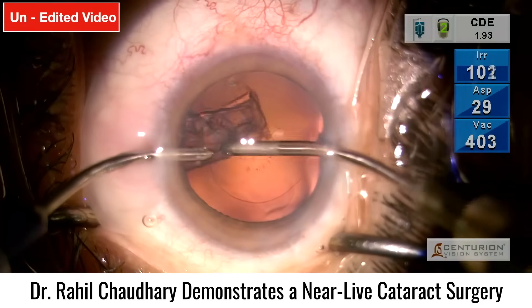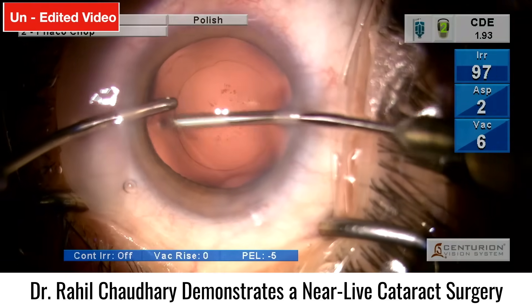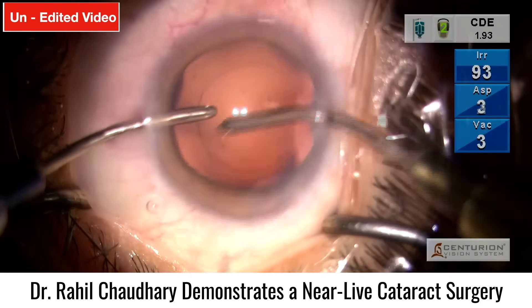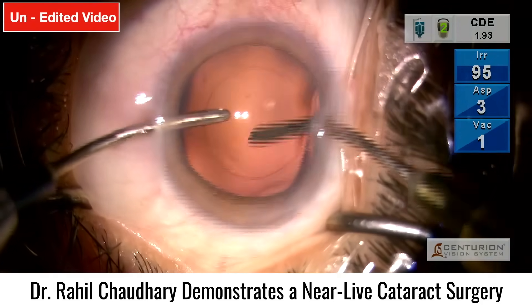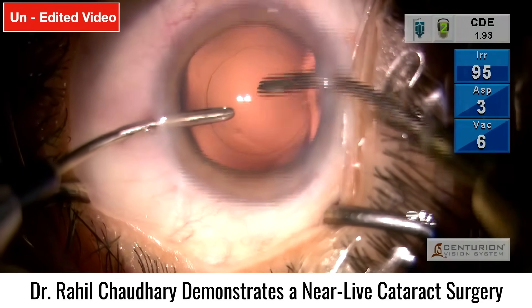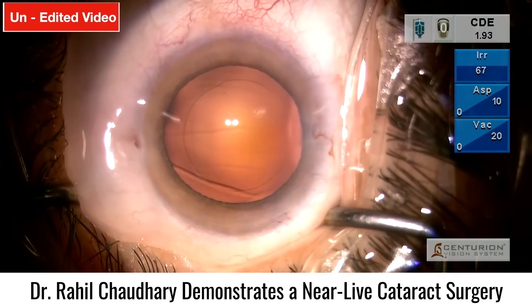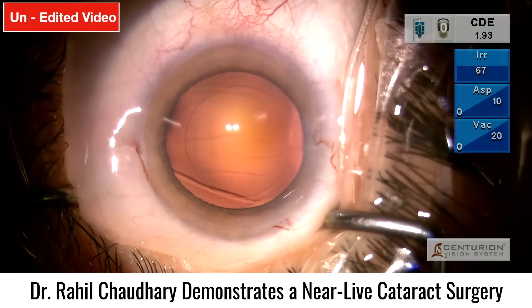Regarding the physics of the PureC EDOF lens, we don't have full clarity from the company, but what we've been told is that it works on the phenomenon of continuous change of power, creating an elongated EDOF focus. We've had multiple EDOF lenses from various companies — from Bausch & Lomb with a dome or donut-shaped disc, the Vivity lens working on the Gaussian beam principle, and now PureC from Johnson & Johnson working on continuous change of power to provide a similar EDOF benefit.